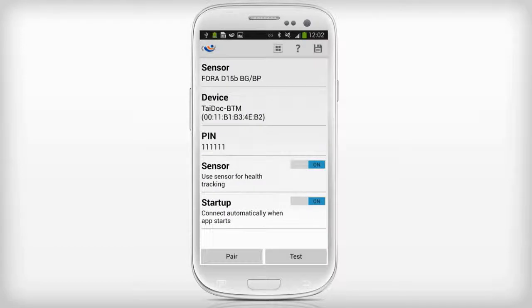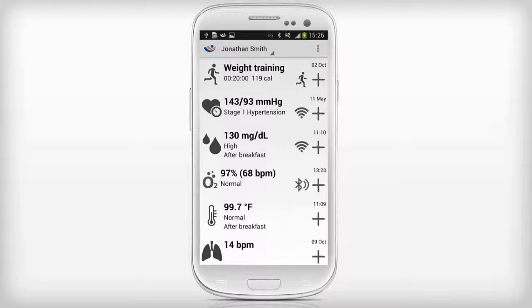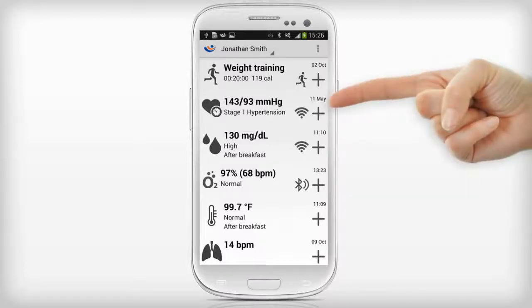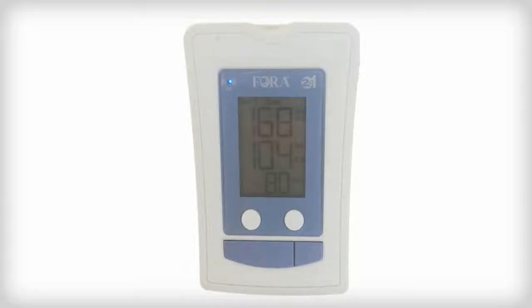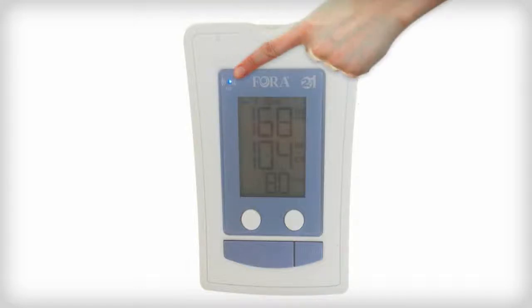Press the Save icon to store your configuration and return to the main screen. In the main screen, you can see that the blood pressure sensor is activated. To take a blood pressure measurement with the Fora monitor, press the Sensor icon. Then take a measurement with the Fora device and check that the blue light is flashing afterwards.